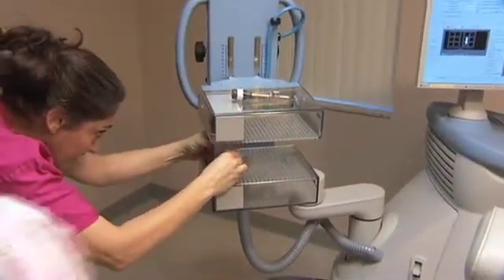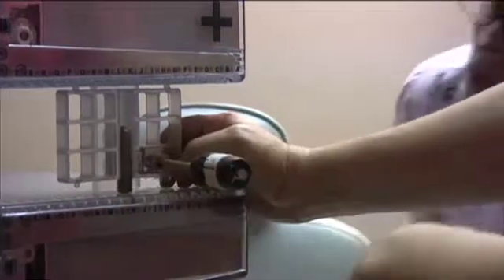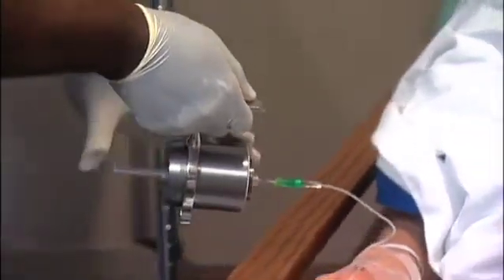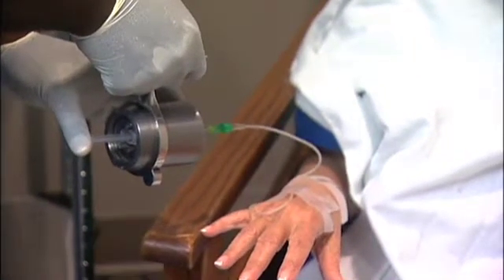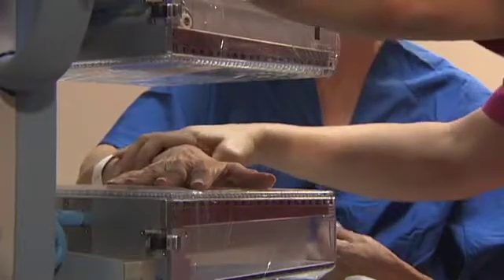During setup, the clinical team may plan the placement of the needle guide holder, the support paddles, and the universal targeting set. Just prior to the equipment setup and calibration, the patient is injected with the radiotracer FDG18, a radioactive sugar. The patient is instructed to rest quietly for about one hour to allow the radiotracer to work its way through the body.